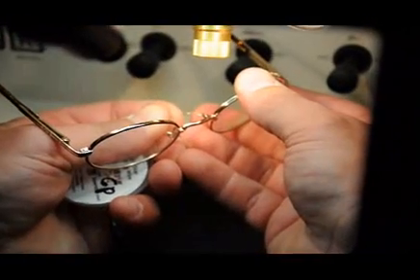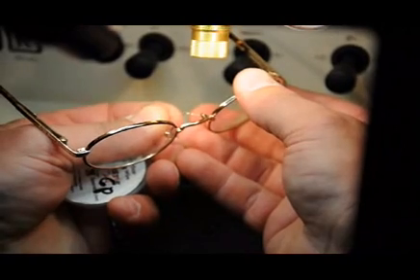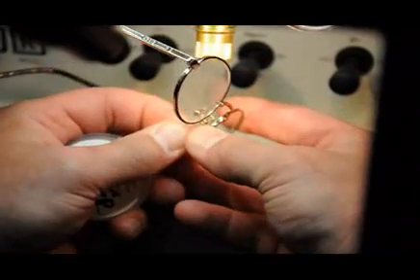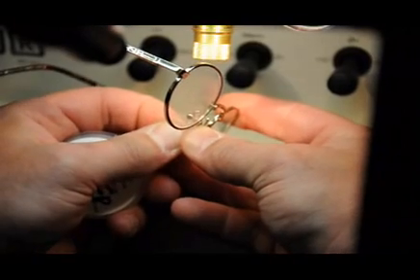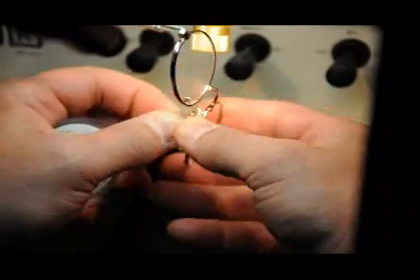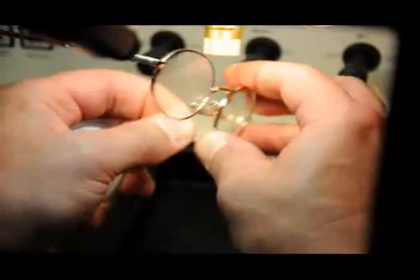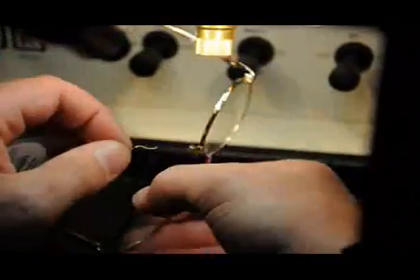The operator is adding a few more deposits of gold. This is an extremely small amount of material. The wire that we're using is only 10 thousandths in diameter. Argon gas also improves the weld quality, and by simply twisting the wire, it will break off.